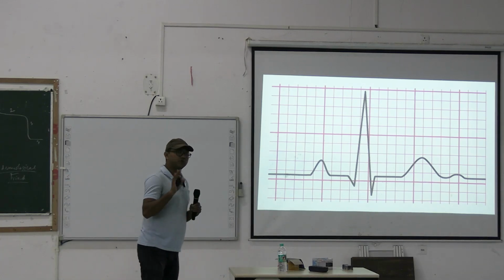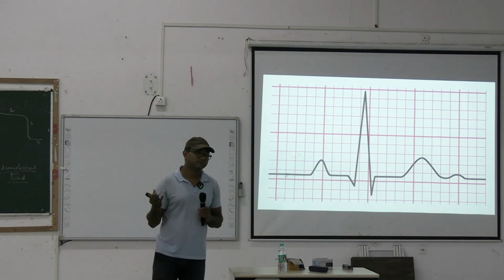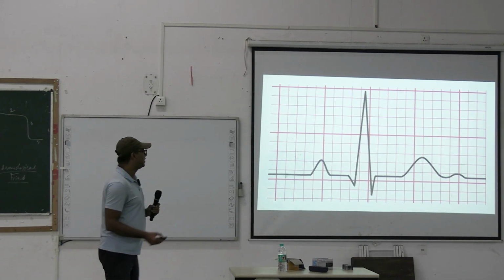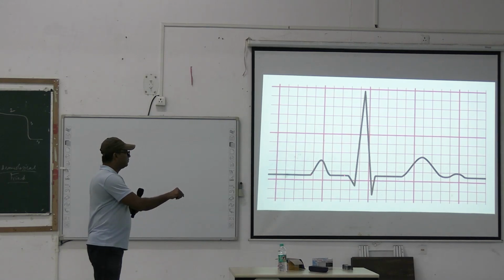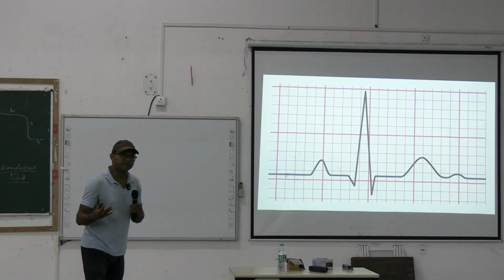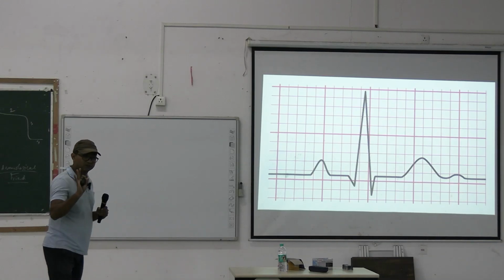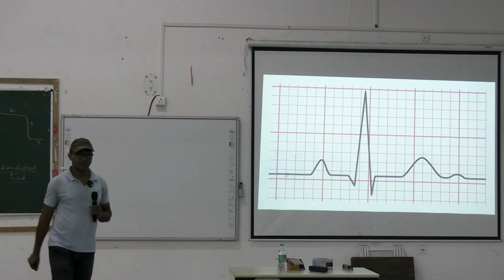So, why do we need to measure PR interval? PR interval keno mapbo? What is its clinical significance? Achha, before that tell me PR interval in time. Okay. So, 1 small square, 2 small square, 3 small square and 4, right. Ekhaneo ekটু gap ache, so we can consider 4, right. So, more or less 4 small squares, okay.